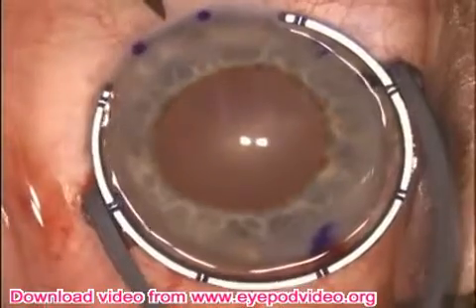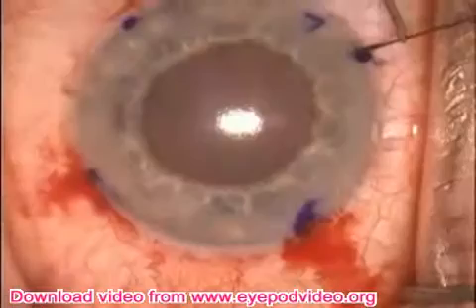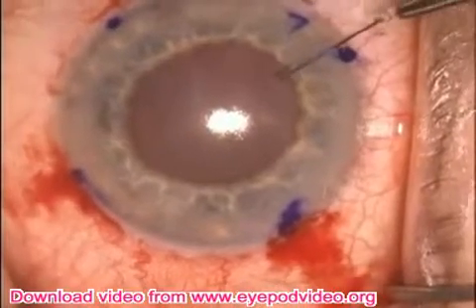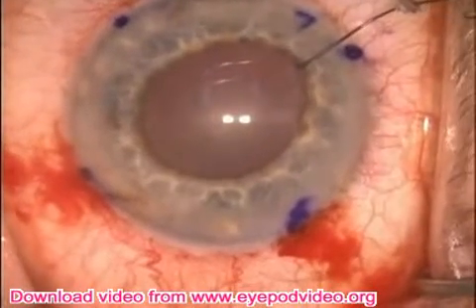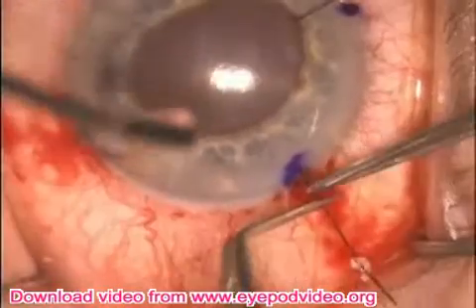We've made the other three, and now the last incision is made just posterior to the area of the planned clear corneal incision. One of the hooks is placed through the small paracentesis and cinched down into position.